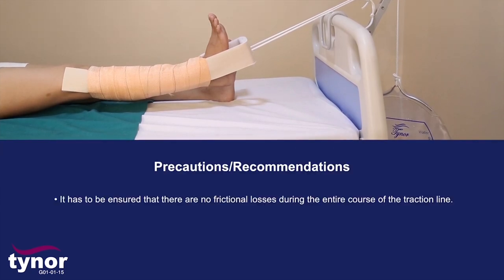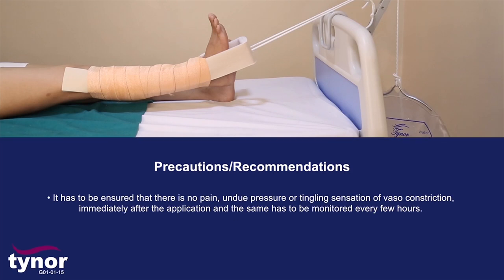Precautions: It must be ensured that there are no frictional losses during the entire course of the traction line. It must be ensured that there is no pain, undue pressure, or tingling sensation or vascular constriction immediately after application, and the same has to be monitored every few hours.